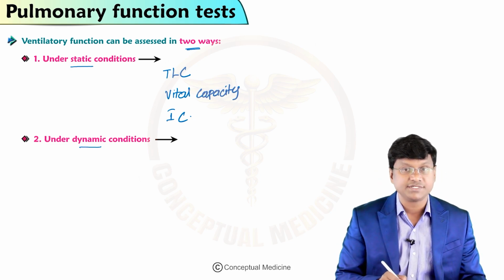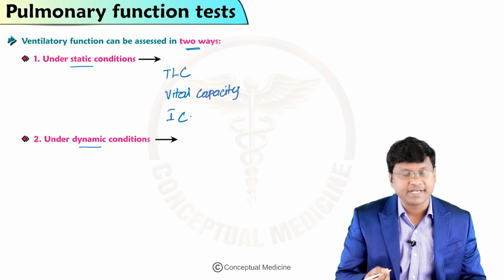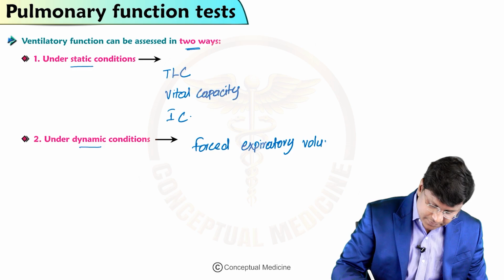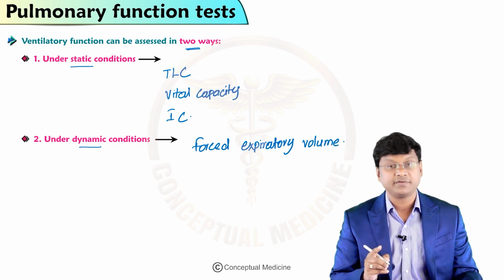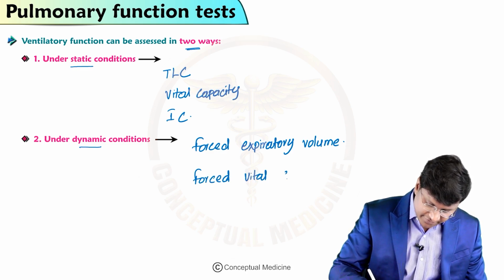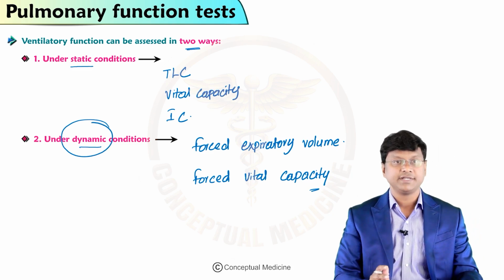Whereas under dynamic conditions, the volumes or capacities which are measured are forced expiratory volume, and another important parameter, forced vital capacity. So these are the volumes and capacities which are measured under the dynamic conditions.